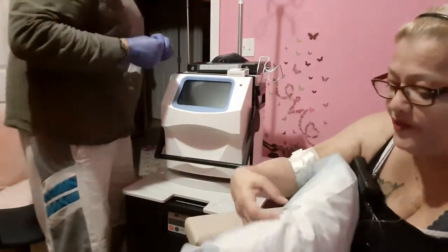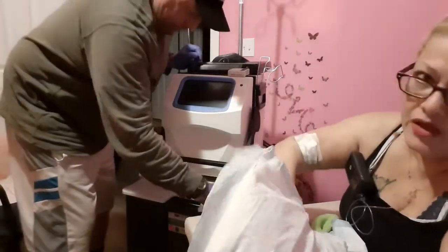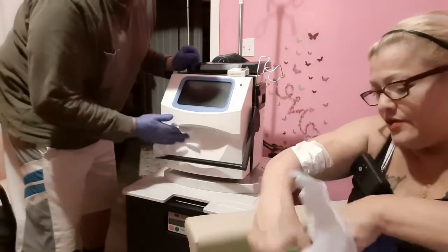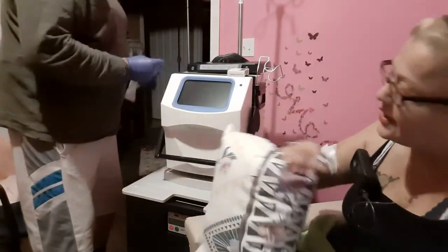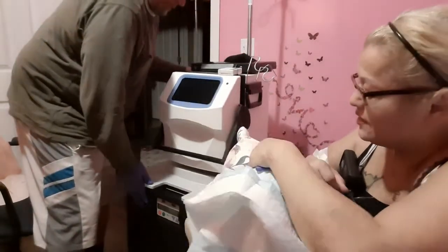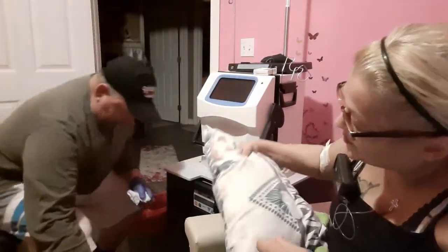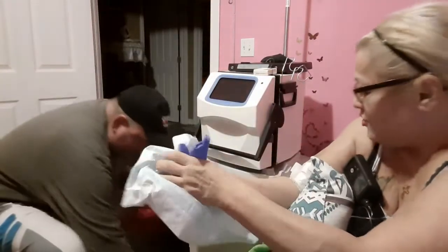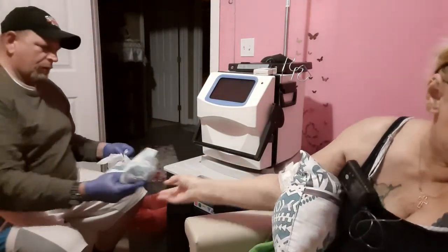So I've taken off my gloves. And now I take the shuck off this pillow, which I use as an armrest to keep the needles in. Okay, take all the tape off. All right, all the tape is off, and this goes in the trash. And that's it.